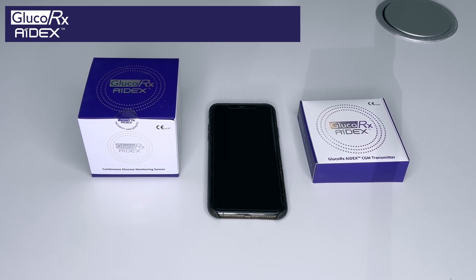Today we're going to look at the new GlucoRx AiDEX CGM. CGM stands for Continuous Glucose Monitoring. With these devices it enables you to check your glucose every five minutes, 24 hours a day for 14 days.